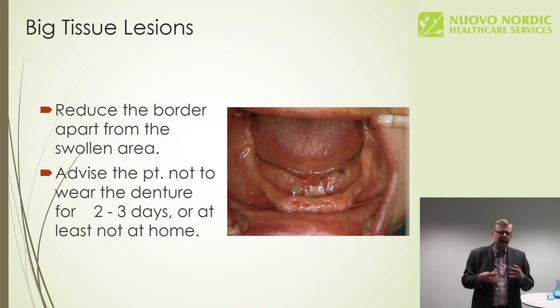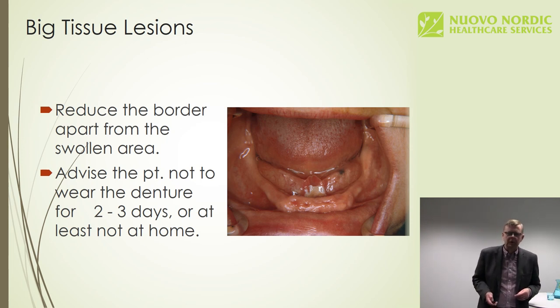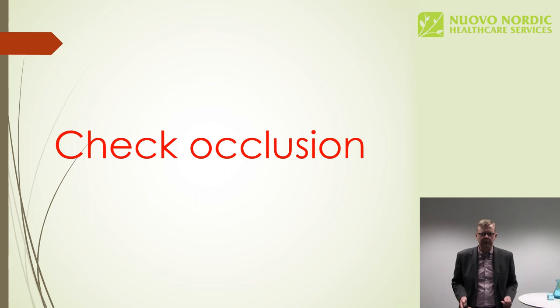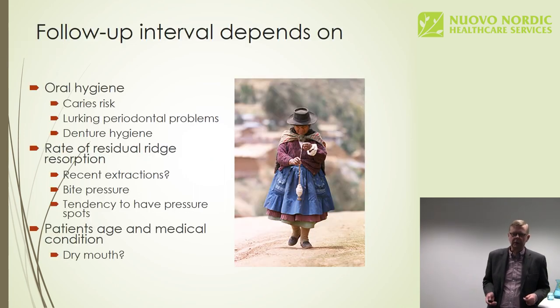So if we have a clear wound, it will take a bit more time for it to heal, and the patient will not be wearing the denture for a couple of days. And of course we'll check the occlusion again.